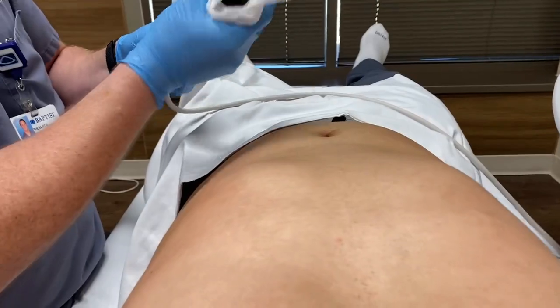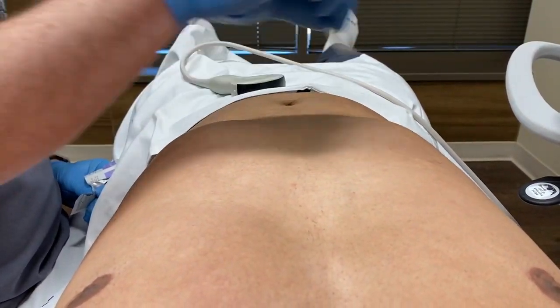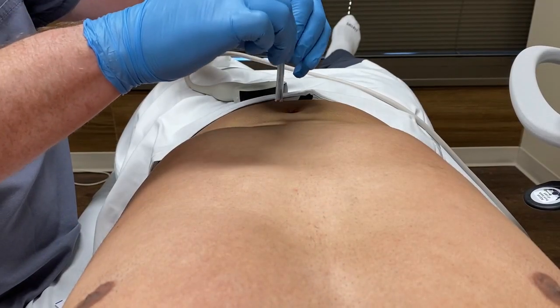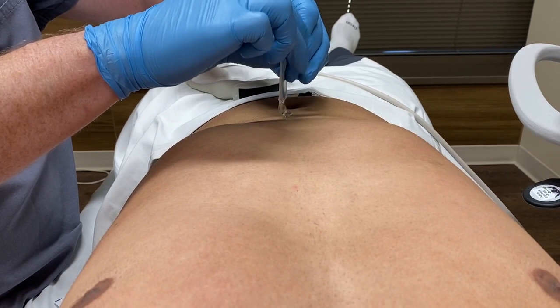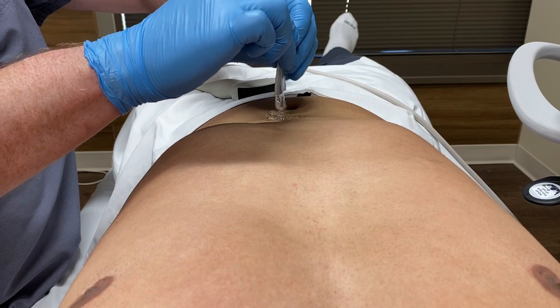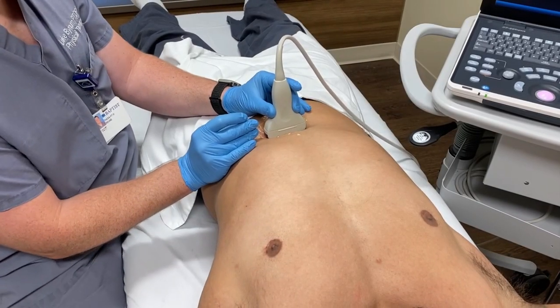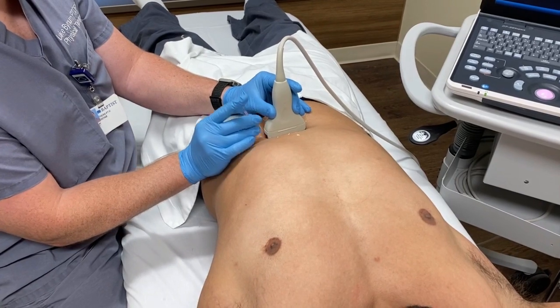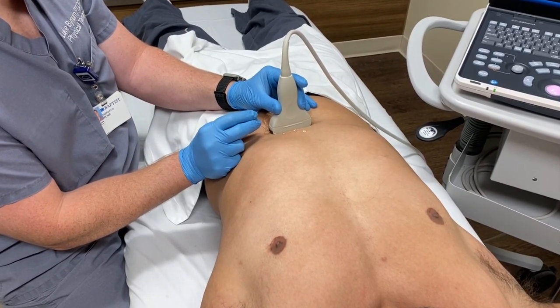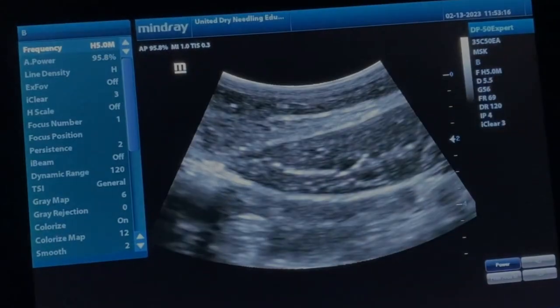You see a quick video of cleansing the ultrasound head before performing this technique. Always use gloves and always do an alcohol wipe-down — scrub the skin with alcohol prior to performing it. Because we're going to use ultrasound guided dry needling, we'll use sterile ultrasound gel, so I just use those little sterile lubricant packs. You can see the position where we found the rectus abdominis on ultrasound. We're going to use an in-plane needle technique, sticking the needle in-plane with the convex transducer, and then we'll see it on the ultrasound screen in just a moment.